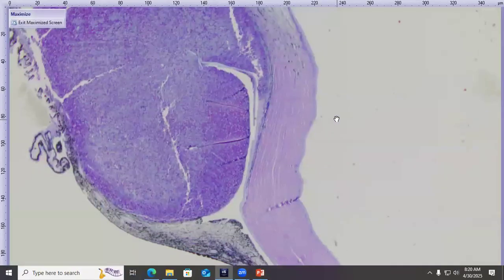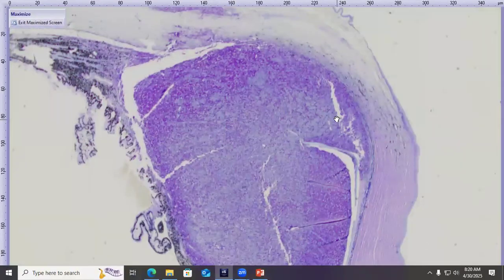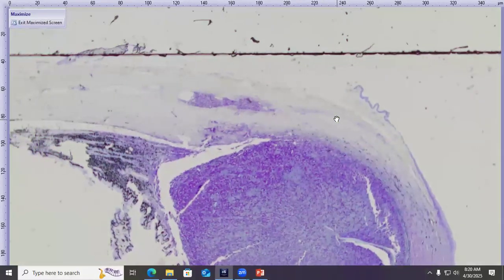What's that? Mastocytemia? No, as far as we know now. Oh, sorry. The question was if this dog had mastocytemia, and we weren't told if there was, but I assume they would have told us. Right. I know that there's a collection of mast cell tumors on the conjunctiva, but I hadn't heard of one on the sclera before.